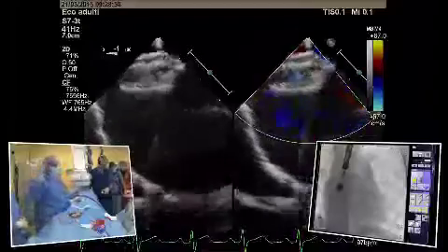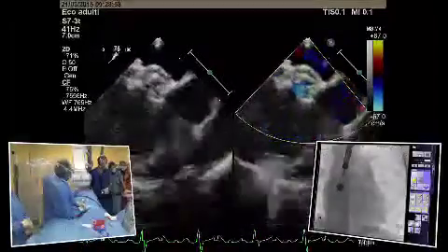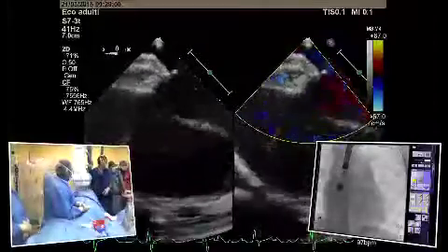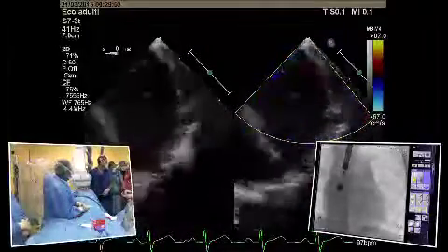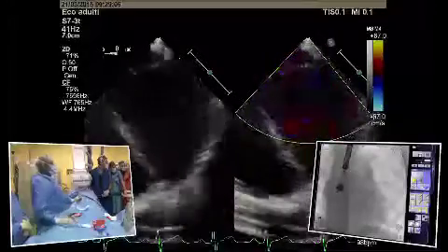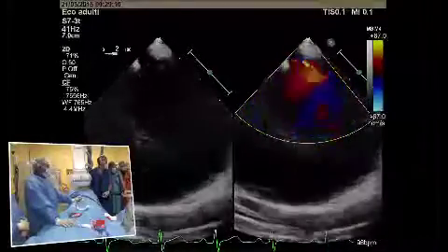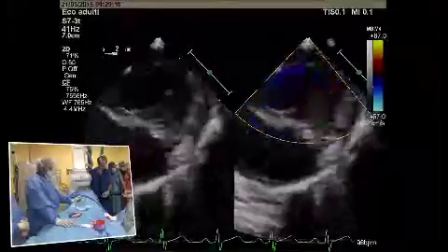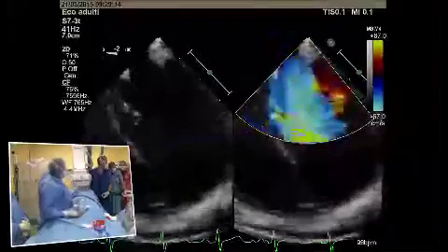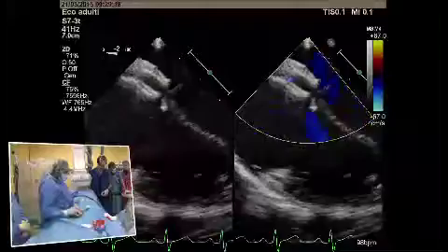So, just close to the mitral valve, but not. A quick look at the mitral valve, Aki, please. It looks okay, isn't it? Okay, yeah. I'm not worried. Do you have any other questions or comments from the panelists or the audience?